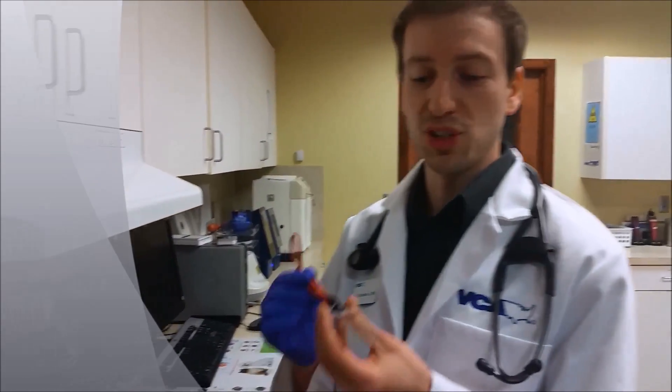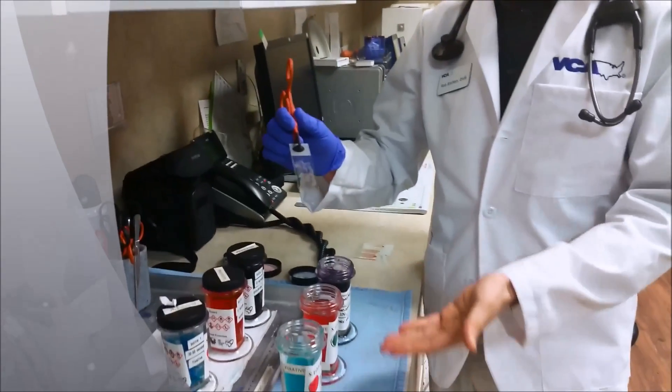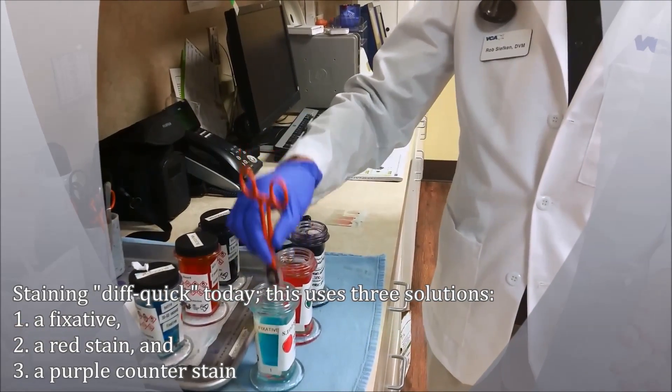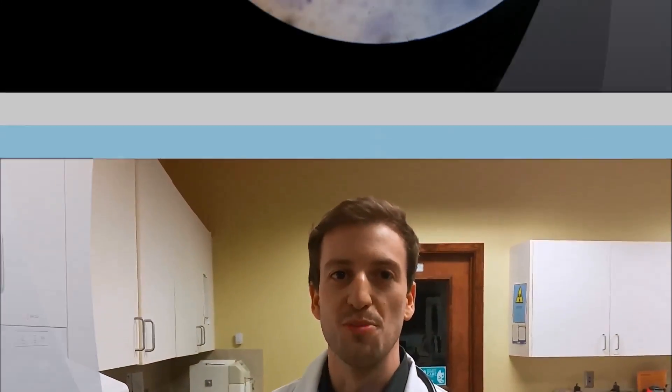So I've got the slide and I'm prepared now to stain it. Some people will heat fix these ear cytology slides because they have a lot of oil to them — I don't like to do that. I worry too much about doing it incorrectly, so I'm just going to let it air dry, and I've done that. Now I'm going to start to stain it and go through the series. I'll start by dipping in the fixative, and then the next time we see you, we'll be looking at it under the microscope.